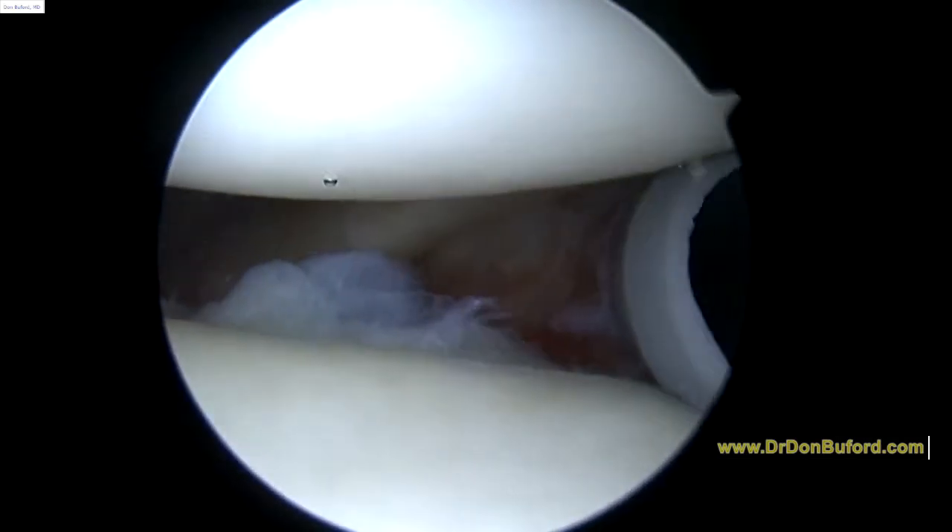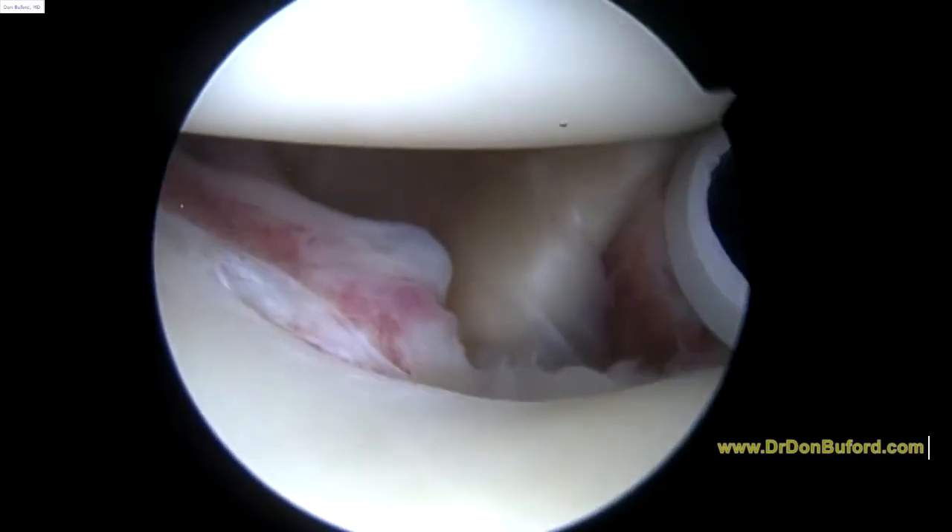Hi Brian, it's Dr. Buefer. We're just getting started on the left shoulder, looking in from the back to the front. Everything you see is magnified 30 or 40 times on the screen.